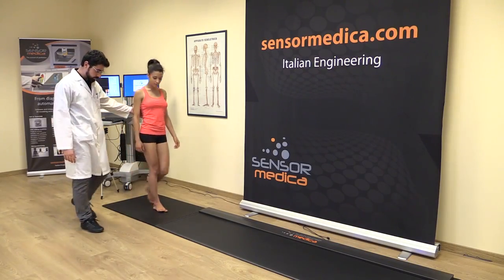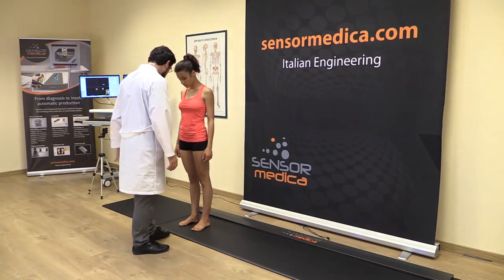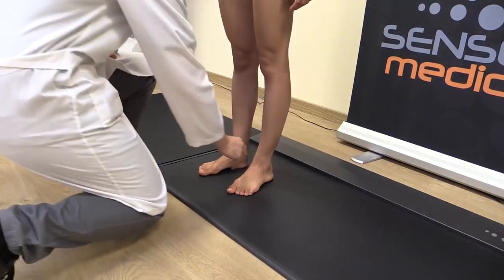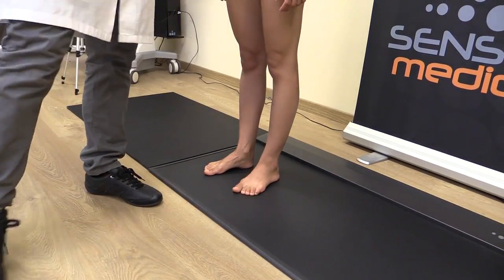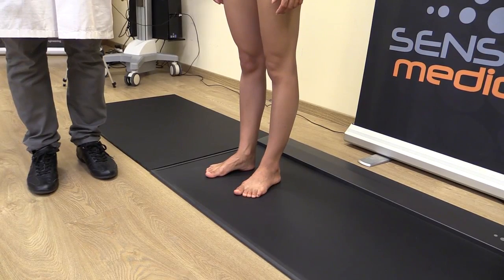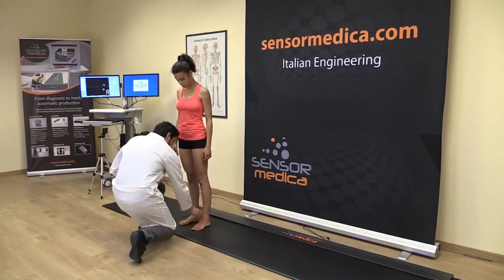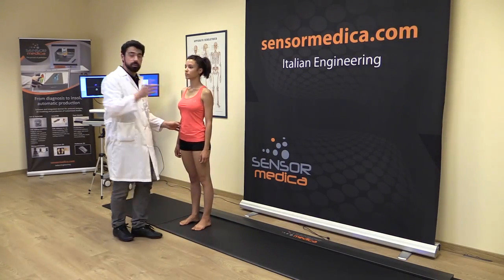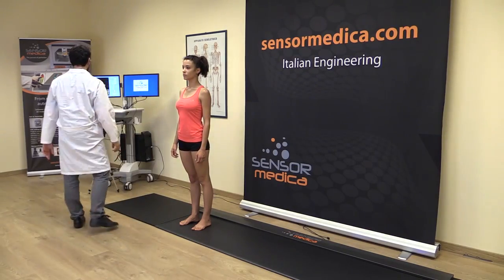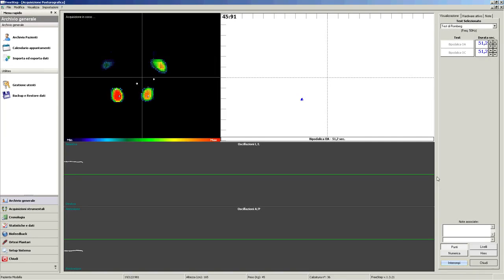Let us place the patient on the platform with his feet in a comfortable and unconstrained position. But anyway, it is better if between the 2 feet there is a maximum distance included between the trochanteric width and the shoulder width, and if the heels are aligned on the same plane. The patient must remain standing, relaxed, face forwards, and his arms down at the sides for the whole duration of the exam. We can proceed with the acquisition of the pressure measurements, checking only that the software completes the data collection.